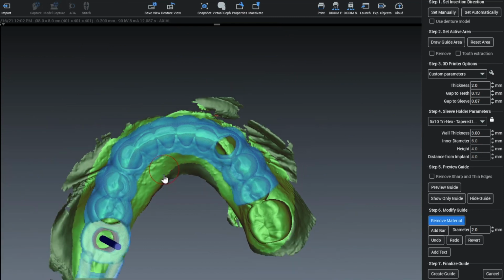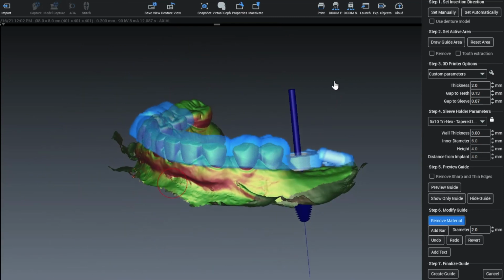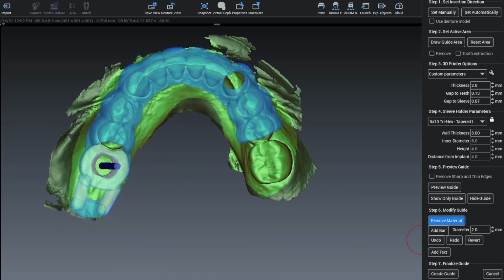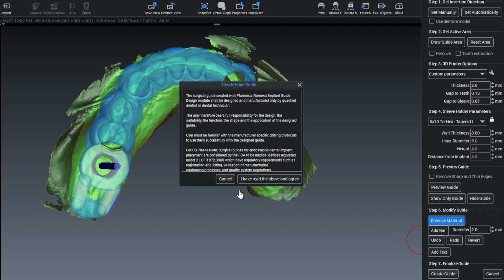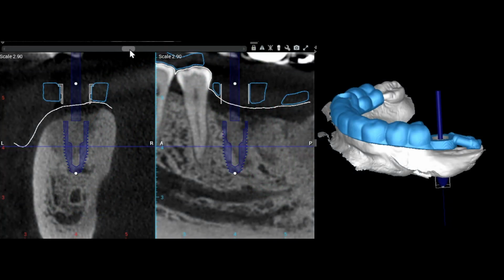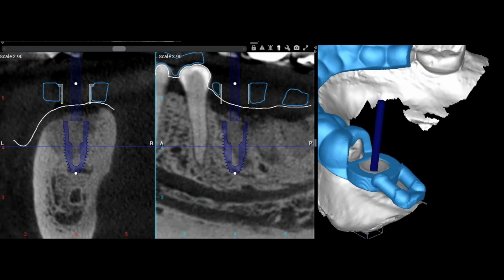We'll do another example here in just a minute, but this is the gist of it. Your intraoral scan extends posterior. You have a surface area that's covered. Again, it only needs to be a few square millimeters. And by adding bars to connect to that, that will eliminate the risk of downward pressure causing the guide to come unseated or to move when you are performing your surgery. So here's the case again. It's site number 19 implant, and we have designed it so that we have some posterior support.